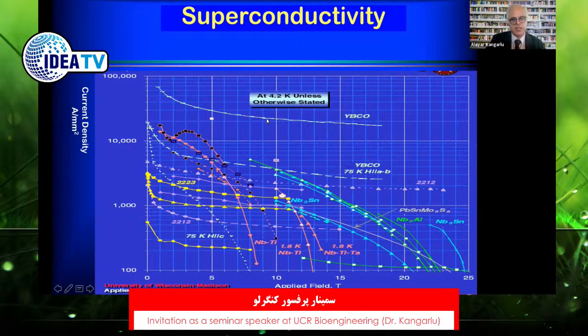I draw your attention to this 800-pound elephant in the room, the yttrium barium copper oxide, YBCO, high temperature superconductors that have been discovered more than 20 years ago, and we are working on different aspects of their mechanical properties. If they become feasible, we can see how they plateau up to about 20, perhaps even higher Tesla. And someday when we can actually build a magnet from YBCO, we might be able to generate a magnetic field of about 20 Tesla in a magnet the size of a laundry machine. That would amount to a revolution in MR.